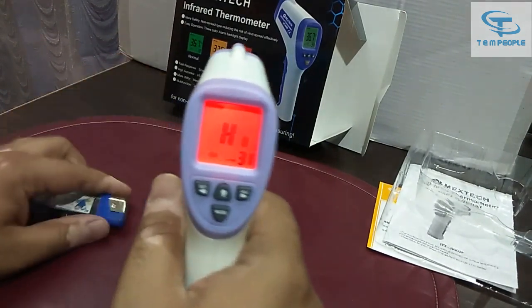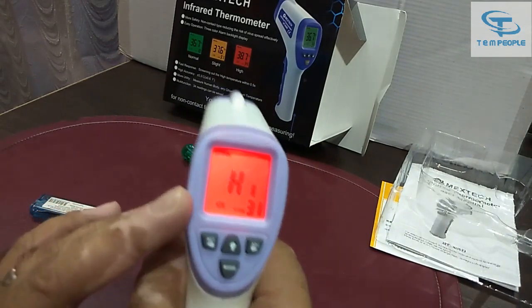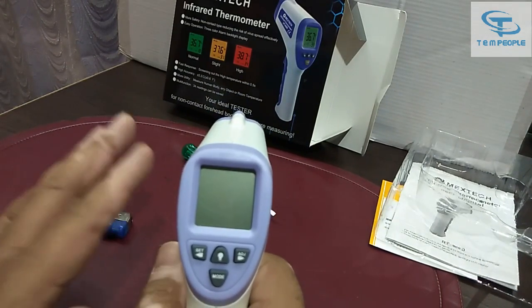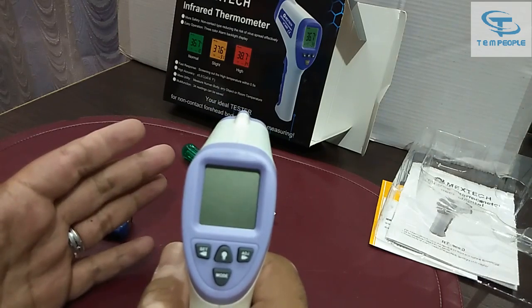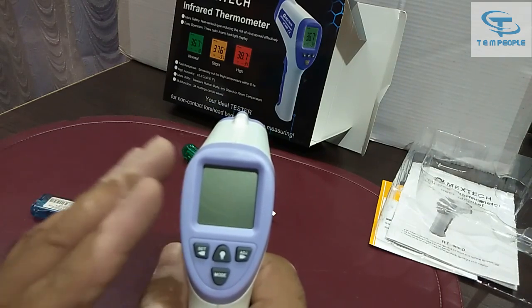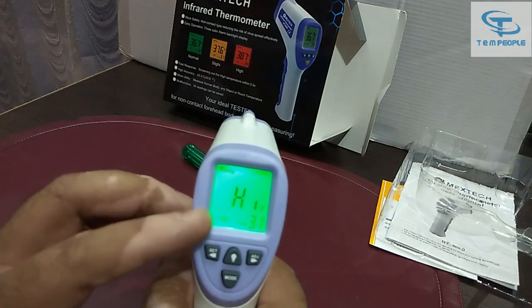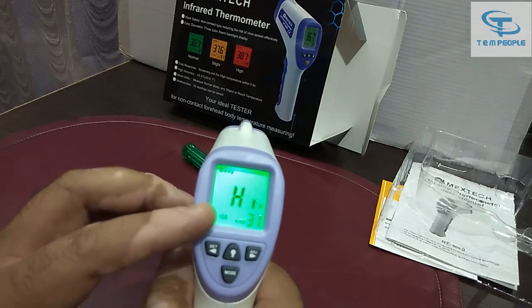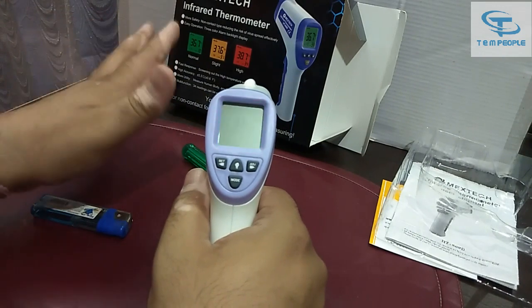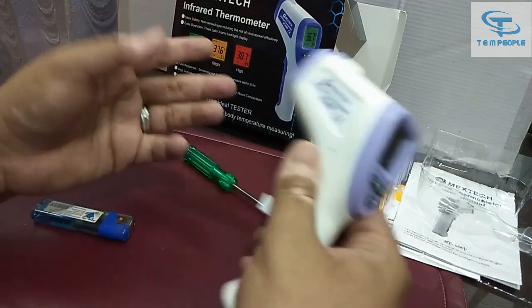The alarm is going off and it is showing a red color, plus it is displaying 'HIGH.' This means the temperature is above the normal body temperature range. You can also check the log afterwards and see it was a high reading, indicating that a person's body temperature is rising above normal.